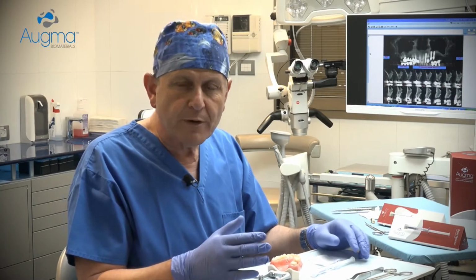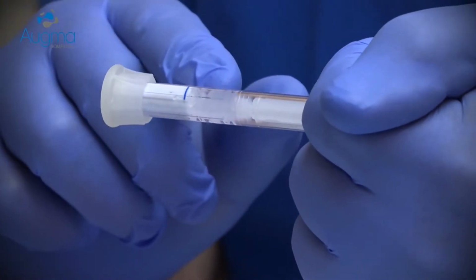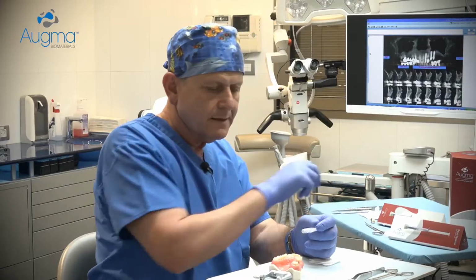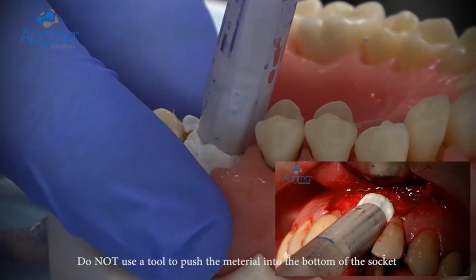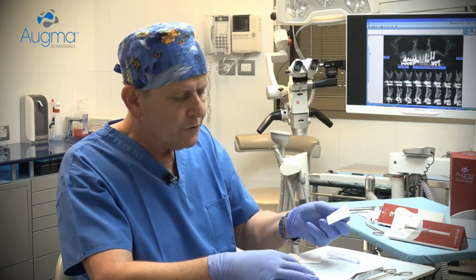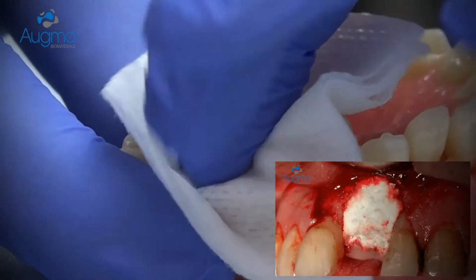Now, I would like to demonstrate how to work with Bond Apatite for socket preservation technique when you don't reflect the flap. Press the shaft against the palm of your hand until the first piston reaches the blue line. Now the material is already activated. Remove the syringe head, approach to the socket site and eject the material into the socket. Slightly overfill it, and now you take a dry gauze and press firmly the material into the socket.